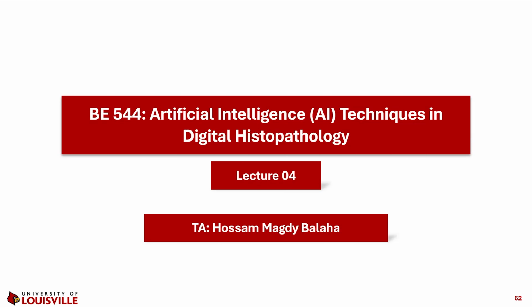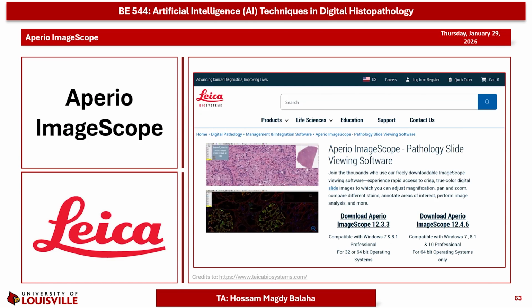Welcome back to BE544. In Lecture 3, we gained hands-on experience with QPath, which is considered an open-source platform that enables annotation, quantification, and AI-ready data preparation. Today, in Lecture 4, we turn our attention to ImageScope.